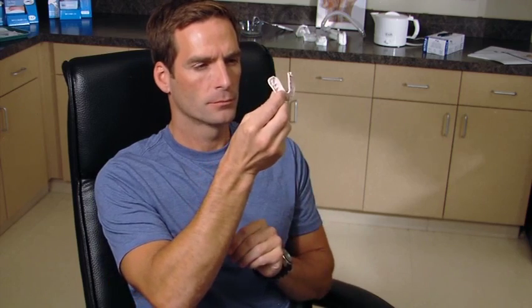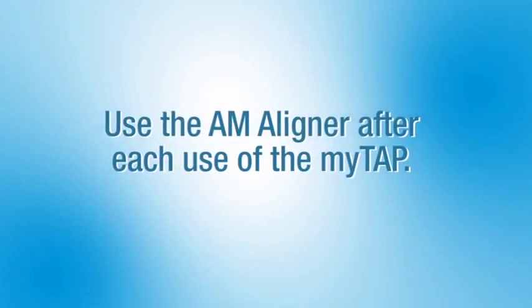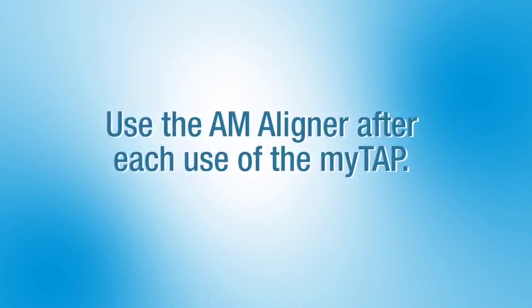Take it out and hold it to the light. You should be able to see light through the bite impressions in the tray. If not, follow the instructions to refit the AM aligner and bite harder into the tray. Use the AM aligner after each use of the myTAP.